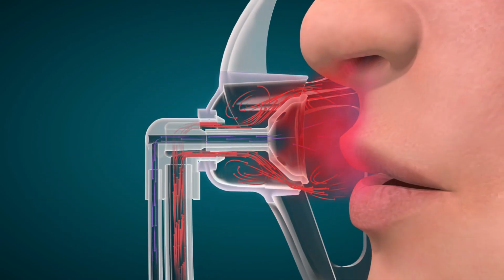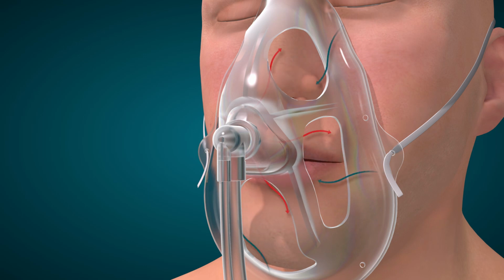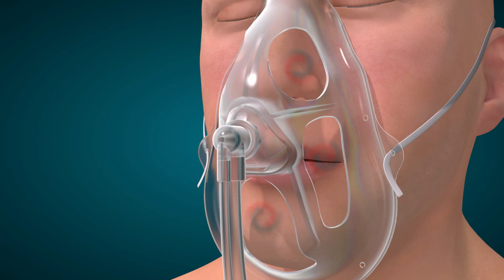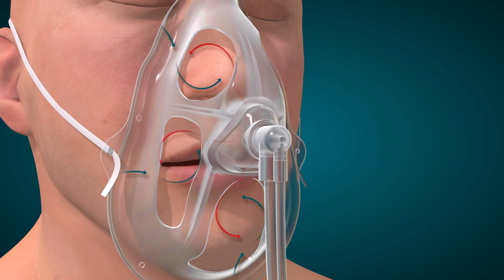The triangular directional diffuser refines the shape of the oxygen vortices and directs the flow towards the patient's nose and mouth. During the patient's inhalation, oxygen flow is mixed with room air drawn in through the mask openings. Respiratory mechanics and breathing patterns determine how room air combines with the delivered oxygen. The concentration of oxygen received during the breath is a function of the oxygen flow compared to the patient's inspiratory flow and tidal volume. During exhalation, although the mask openings allow expired carbon dioxide to escape, the mushroom-shaped pin that is linked to an end-tidal CO2 sample line allows for expired carbon dioxide to be monitored. The sample line can be attached to a side-stream ETCO2 monitor to obtain tracings.